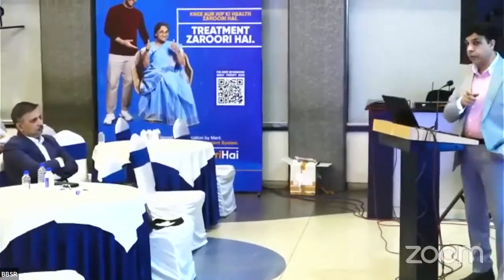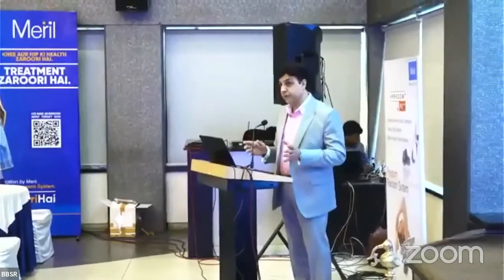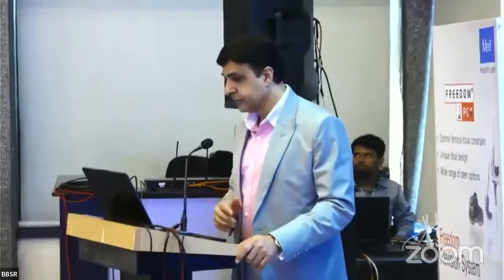There is a coronal bowing, which Dr. Naik was talking about. You have to have a mismatch. And again, you have to size the AP and the ML. So my point, again, is smaller-size North Indian or Indian females with anterior bowing of the femur. How do you manage those things?